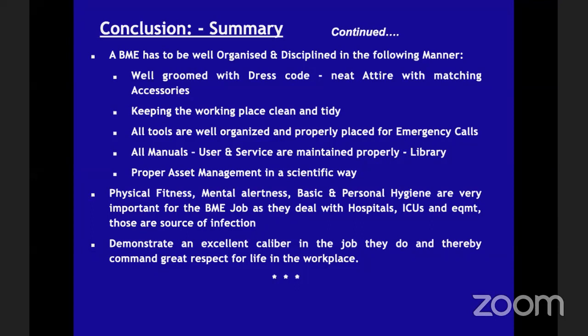The ICU patient can wait because there is a doctor, he can manually ventilate the patient. The cautery can also wait. There are 4 or 5 doctors there. The patient under anesthesia, his respiration is taken care of. But the defibrillator patient cannot wait. You delay, he will die. The golden time is gone.